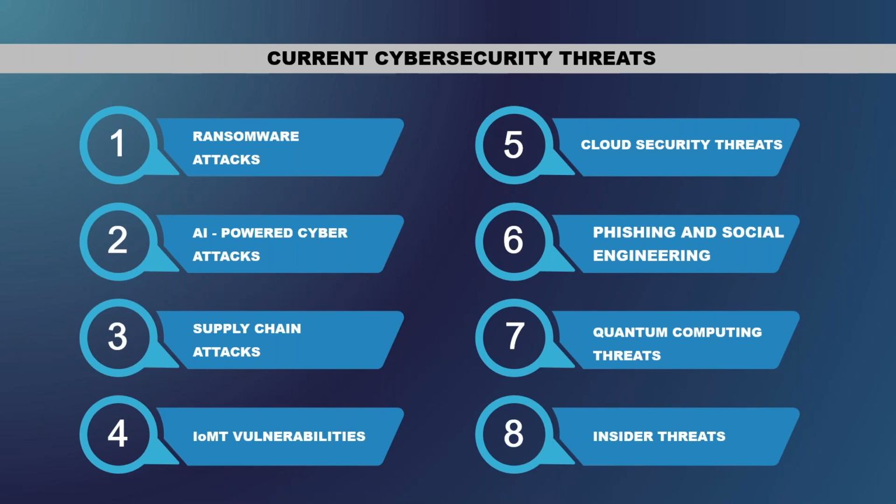So they target patient portals or they can steal sensitive data. Supply chain attacks and third-party vendors can bring a hospital system to a halt, especially if it utilizes outside billing or other IT provided that's not on site, like Change Healthcare could be a good example. And then there's also phishing, social engineering and insider threats that are always a concern that needs to be addressed and combated. In 2024 alone, I think phishing accounted for over 60% of healthcare breaches per Verizon's data breach report.